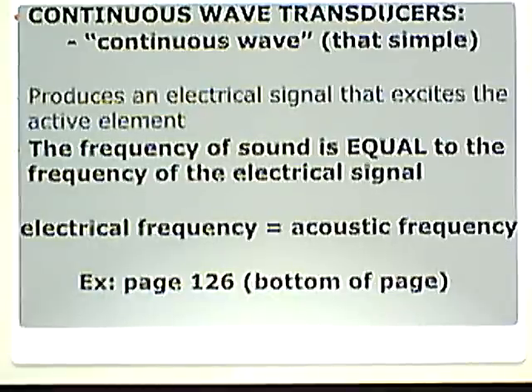So continuous wave transducers. Continuous wave. It's always on. There's no off time, right? It's that simple. It produces an electrical signal that excites the active element. The frequency of sound is equal to the frequency of the electrical signal. The electrical frequency equals the acoustic frequency.